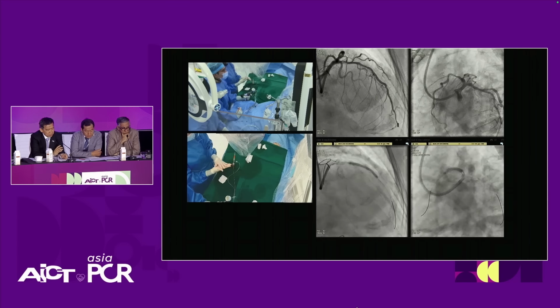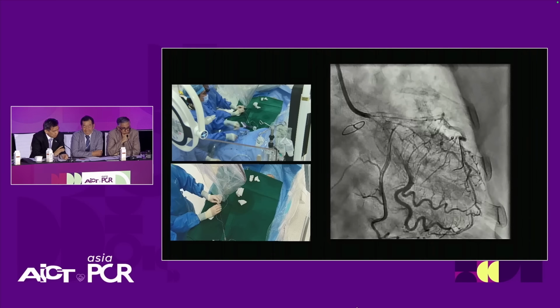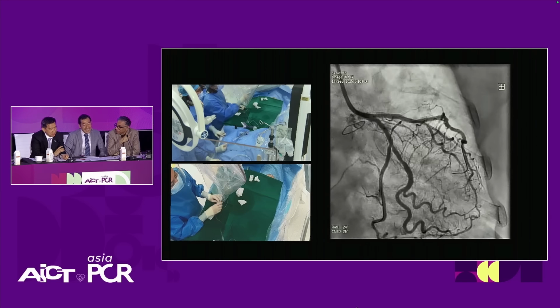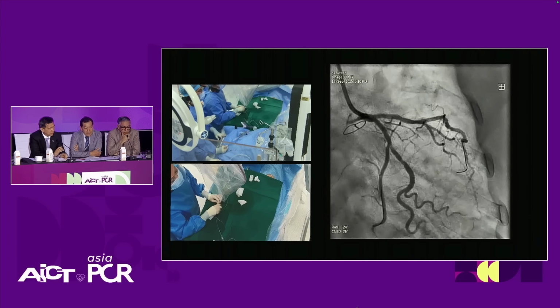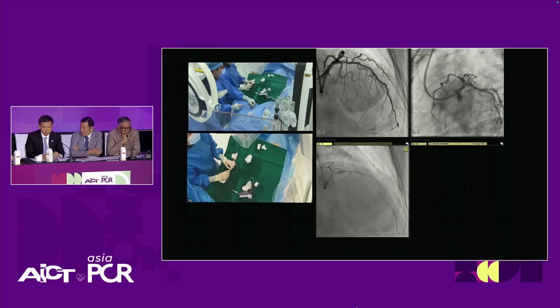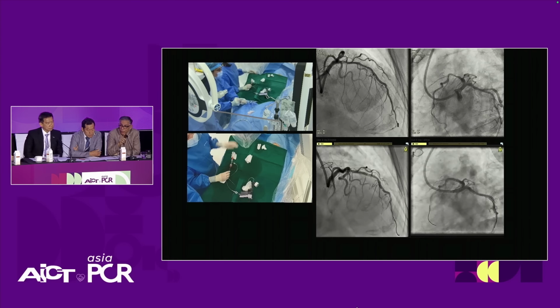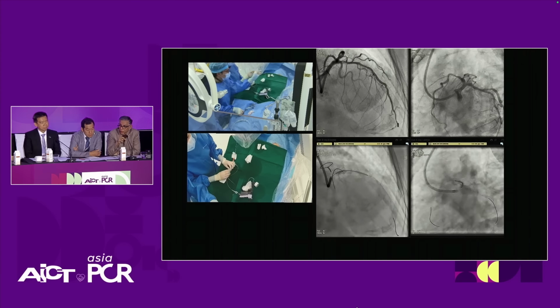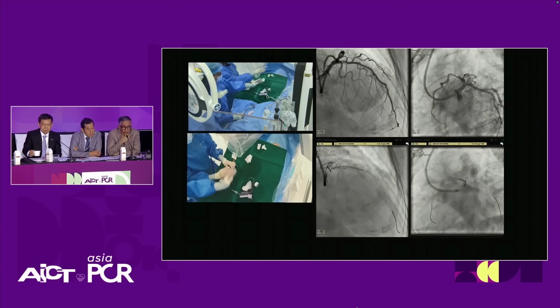and is there any point where you won't use a DCB based on the IVUS findings? Yeah, I agree that if you use a DCB strategy, don't even look at the post-preparation imaging. They're going to be ghastly. Look at angiographic dissection, A and B, non-flow limiting. I will accept that. I think that's borne out by anecdotal and all the case experience that we have already. Sometimes we get scared off by the IVUS. The dissection data is really related to stent and dissections. The adverse data for dissections in balloon-only is not that substantiated. So I agree. If it looks good on the angiogram, just leave it and go.